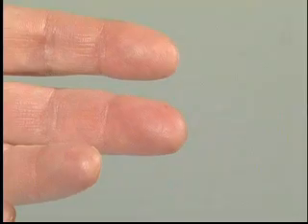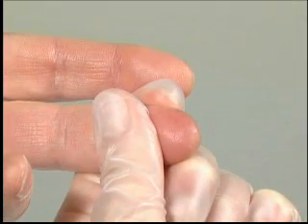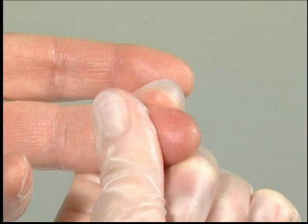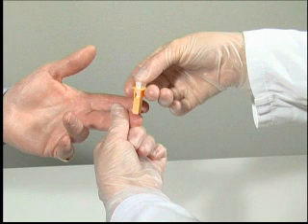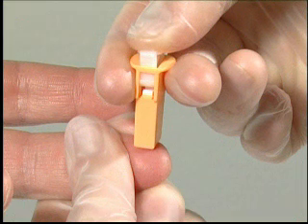Using your thumb, lightly press the finger from the top of the knuckle towards the tip. This stimulates the blood flow towards the sampling point. For best blood flow and least pain, sample at the side of the fingertip, not in the centre.